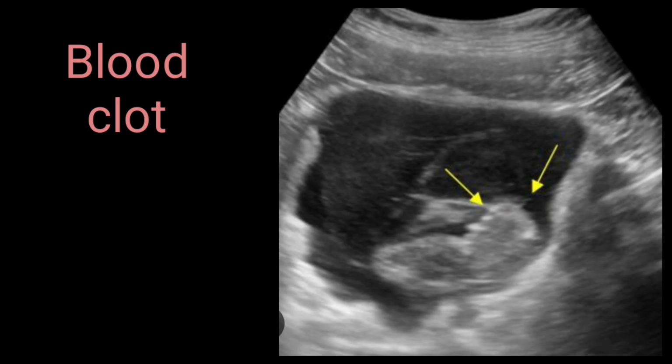The patient was diagnosed with bladder cancer, and after that, due to the instrumentation, the bleeding occurred again. So this is the blood clot, and the patient came to the emergency with retention of urine because it is blocking the urethral orifice. When scanned, it was confirmed as a blood clot. The patient was asked to move to the right and left side, and obvious movements of the clot were visible. So on the basis of the ultrasound imaging and previous history of instrumentation, it was confirmed that the patient has a blood clot.